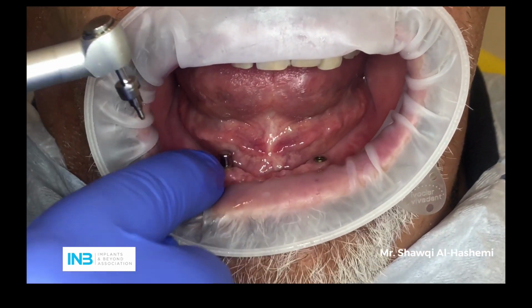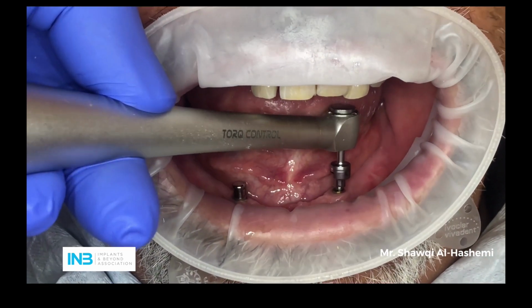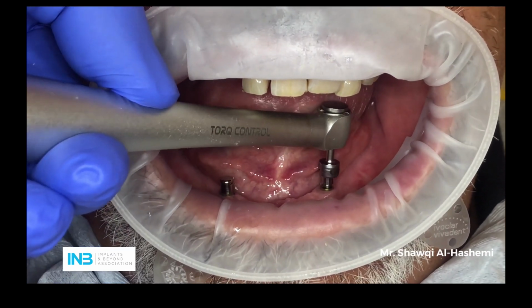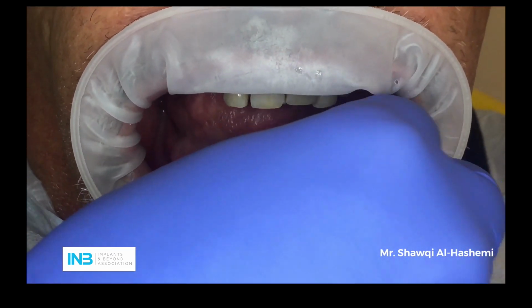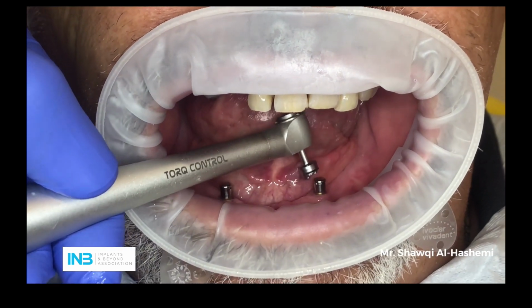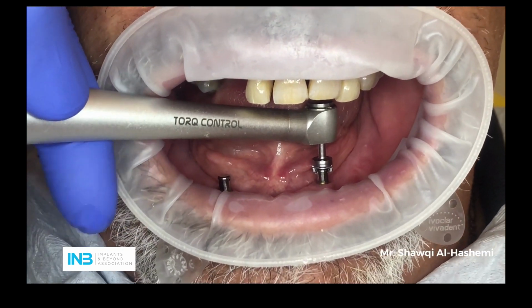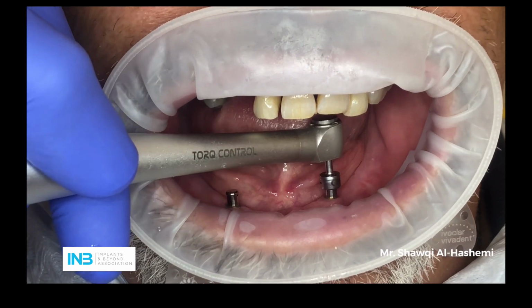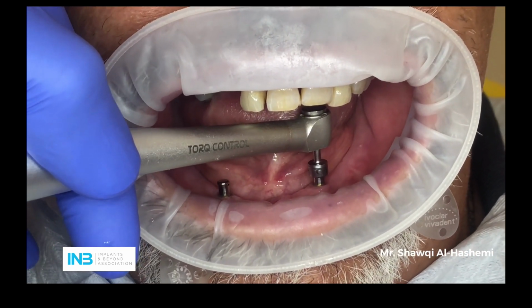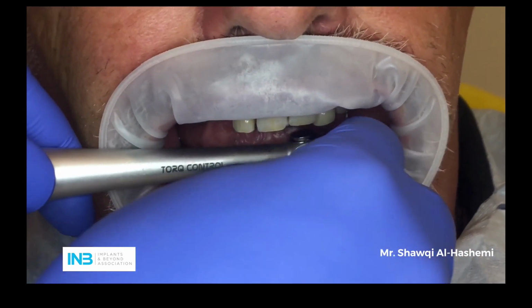Now, as we have previously demonstrated placing this abutment, now we're going to demonstrate how to do the left-hand side, and exactly the same thing. So just go gently in the beginning, making sure that it is seated fully. Okay, so you can do it manually first, right? And now you just come with your torque and you just slide it in this way, making sure it is fully engaged. There you go. And that's 10. Now you can torque it to 20 Newton in the beginning, and then you go 25 and then go 30. So that's 30 Newton.